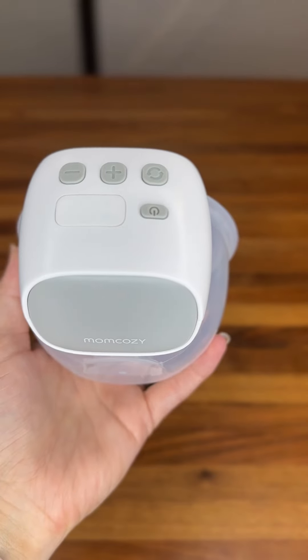One of my least favorite things about the Mom Cozy S9 Pro is that it doesn't have a timer. I normally pump for 10 to 12 minutes at a time whenever I pump. The Mom Cozy S9 Pro is held in with silicone and it snaps in really easily.